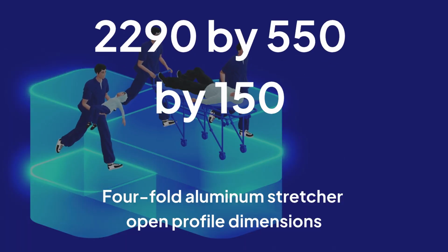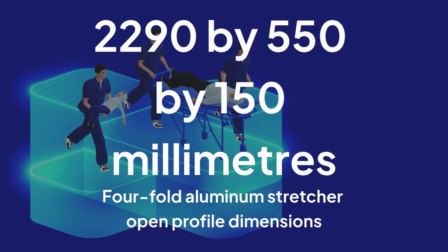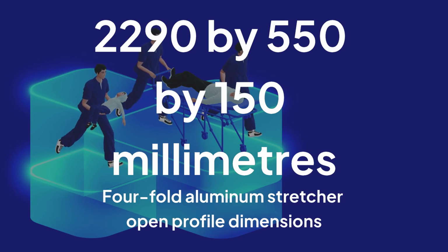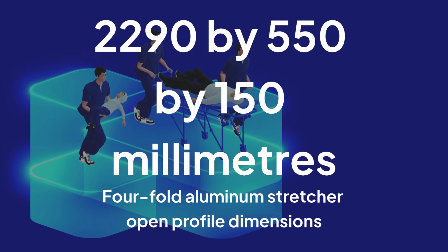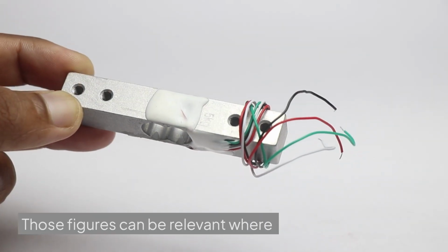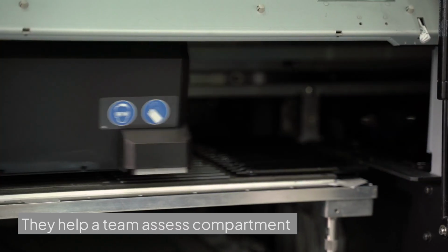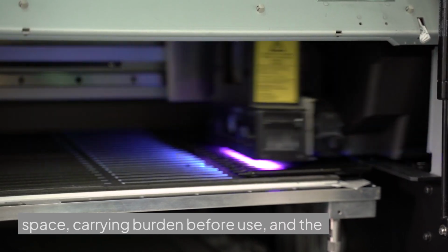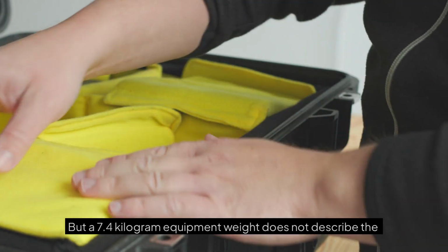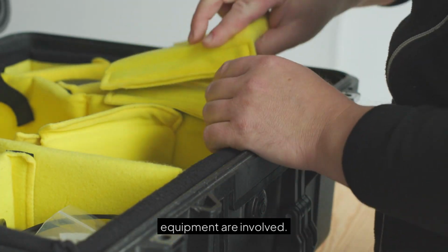Consider a 4-fold aluminum stretcher with an open profile of 2,290 by 550 by 150 millimeters, a folded profile of 530 by 210 by 160 millimeters, a net weight of 4 kilograms, and a stated load-bearing figure of 159 kilograms. Those figures can be relevant where compact storage and rapid retrieval are required. They help a team assess compartment space, carrying burden before use, and the practical shape of the equipment in a defined manual transfer role. But a 4 kilogram equipment weight does not describe the full handling demand once a patient and accompanying equipment are involved.